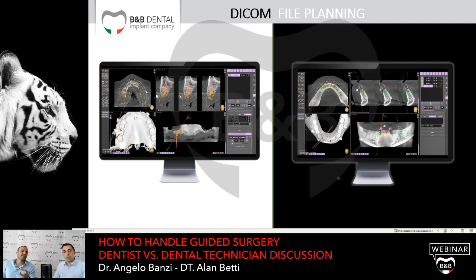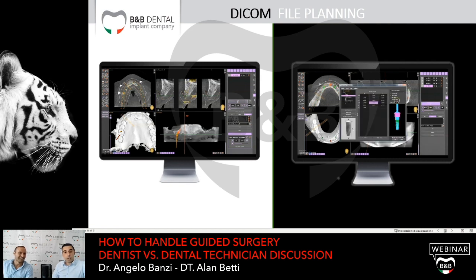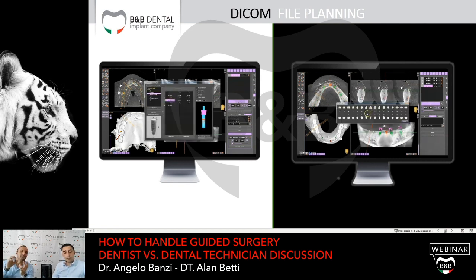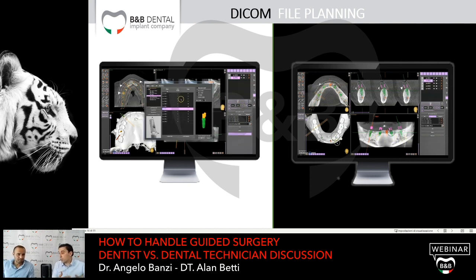It not only simplifies our surgical life, it simplifies all the steps of the system, and also the technician's work. Sometimes the technician has to be really good to cover the implant's mistaken position by the dentist. With the guided technique, this is going to be avoided, and our technician is going to be very happy to work with a good implant position, to facilitate the prosthesis construction.